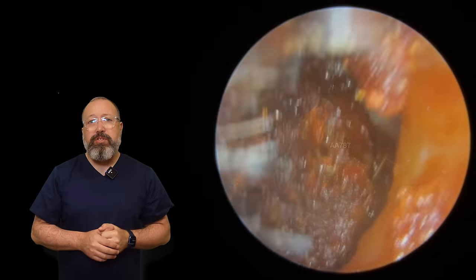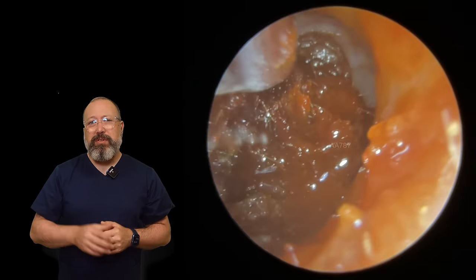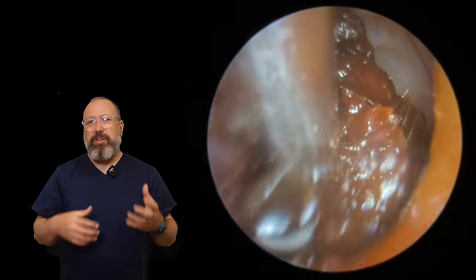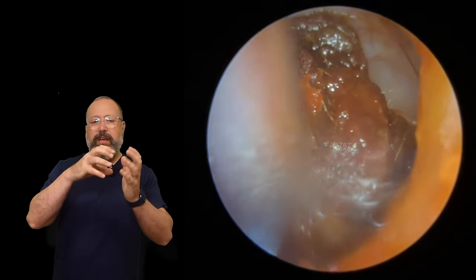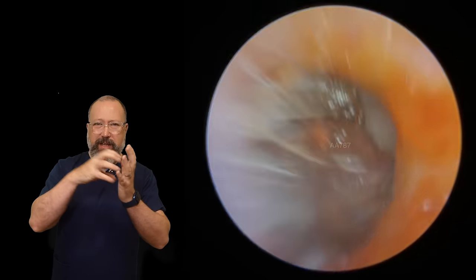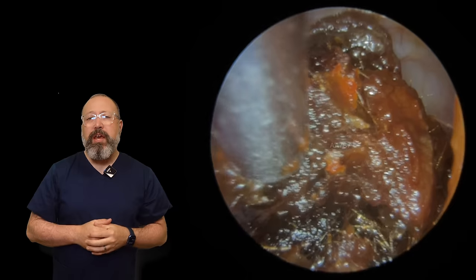We're just breaking little bits off. I've introduced a little bit of olive oil here with the suction tube because it's breaking into small soft pieces. It's almost like a punch into the wax — it takes a section out and that just blocks the suction tube straight away.